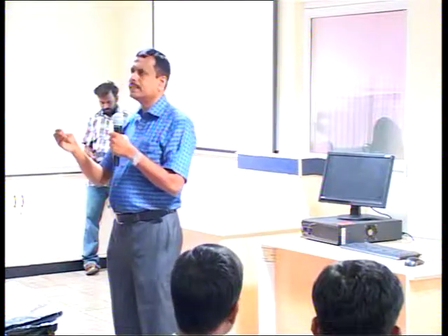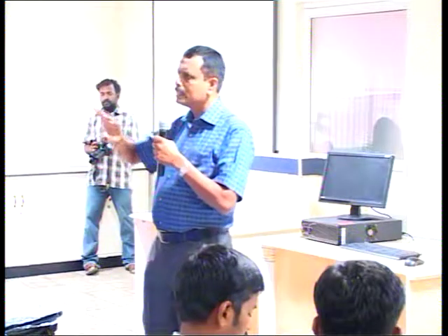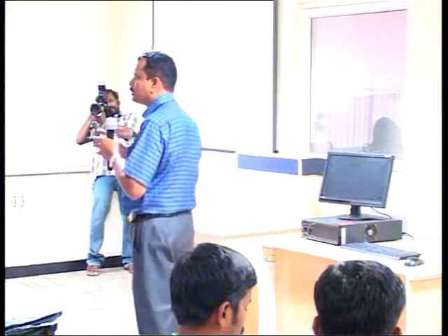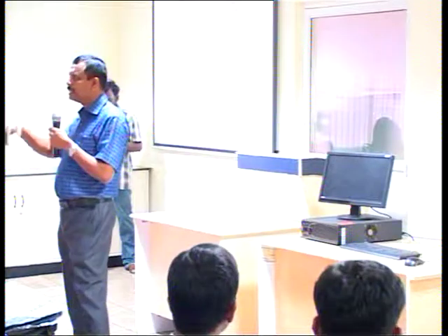So we're trying to get that inside, and not only courses wise, but small scenarios which you are going to be exposed to. For example, mechanical ventilation. Probably you know the electronic components behind the ventilator. What is the mixing chamber, what is the compressor, what's the turbine, all that stuff. But then what is the patient aspect, the patient interface aspect of it also? Don't you think you should know?